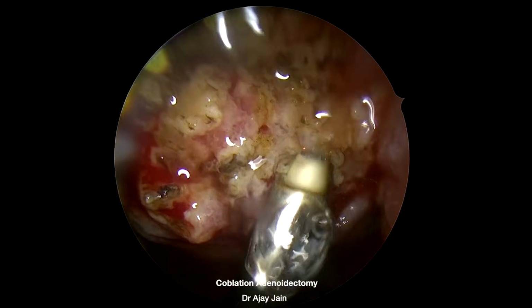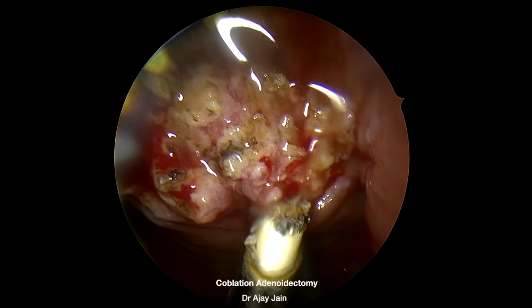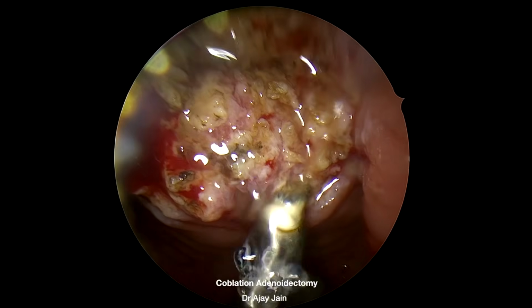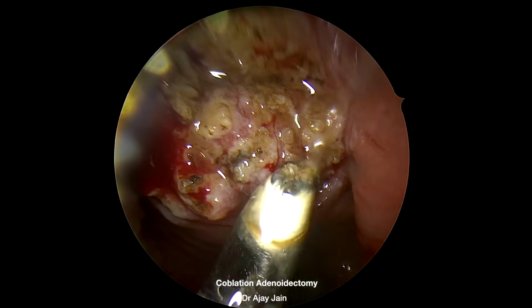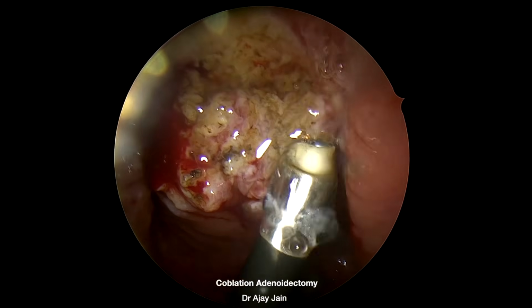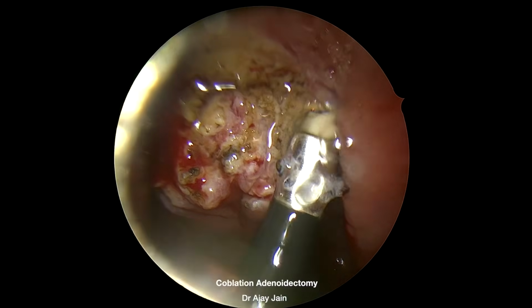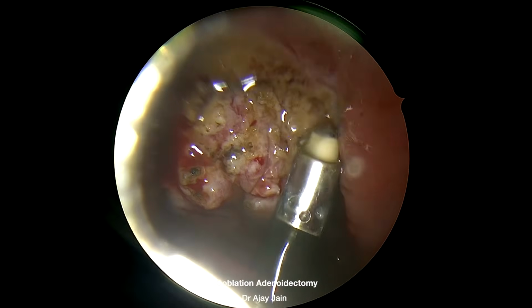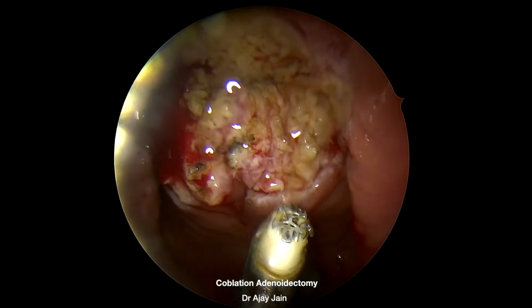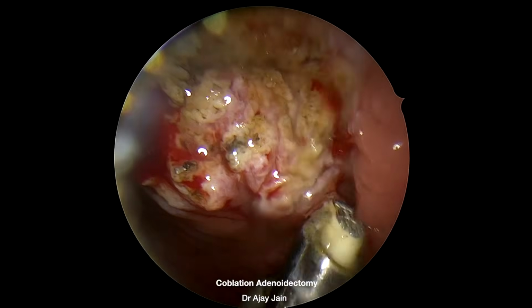After achieving complete hemostasis, I prefer to wait for 5 to 10 minutes before final inspection. Only after confirming a completely dry surgical field is the patient handed over for reversal of anesthesia. See, this adenoid tissue is towards the left fossa of Rosenmüller. So my intuition is saying to remove it. But if you want to leave this now, you can leave.